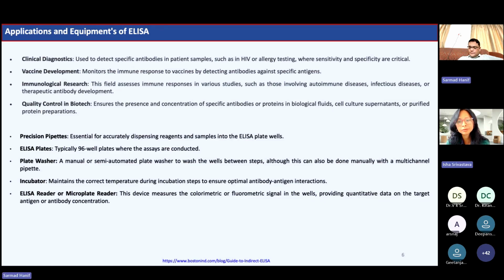For the detection of new pathogens, Dr. Isha, one of the biggest problems is that you don't know the antigen which is giving you the disease. In some diseases for which the ELISAs are established, you have well-established WHO certified antigens available in the required quantity. For COVID or for any other emerging pathogens, the difficulty is that you don't have the antigen.